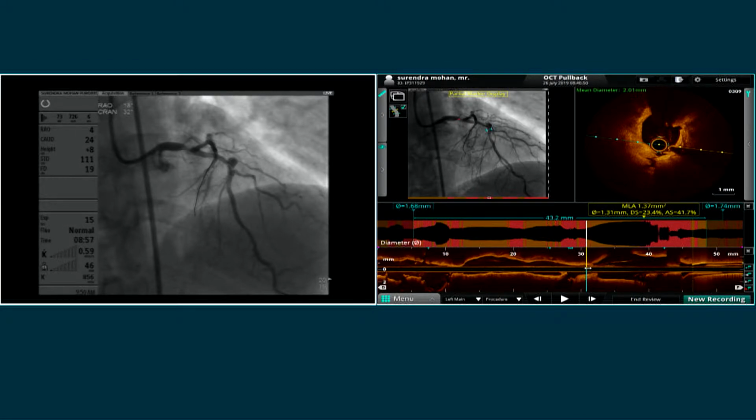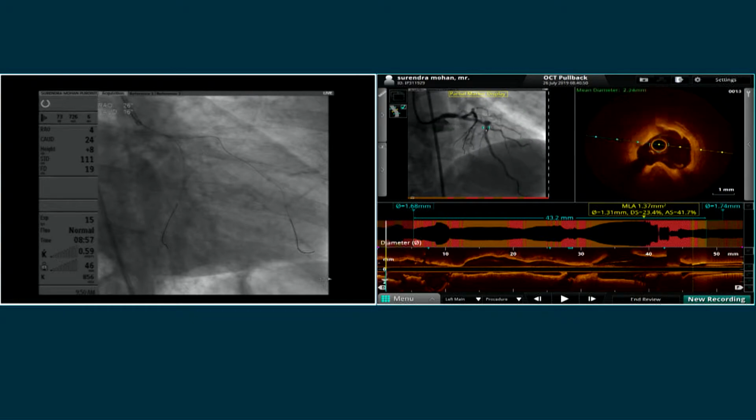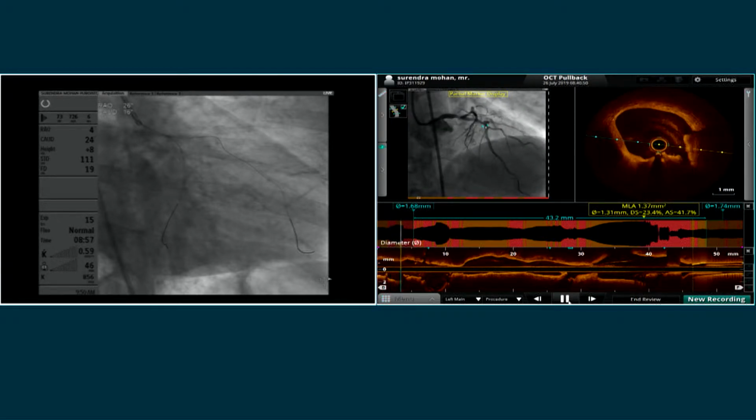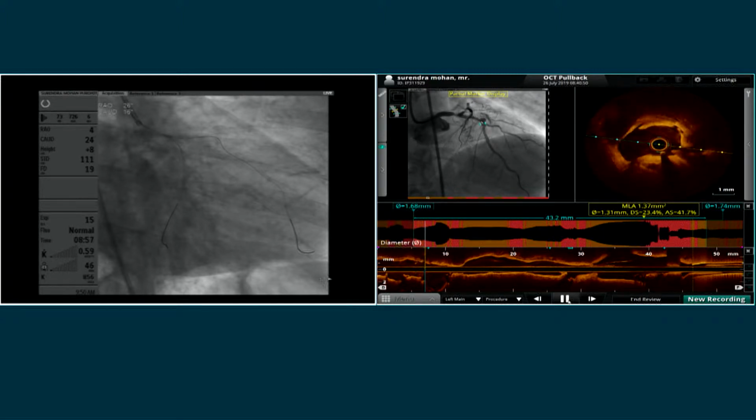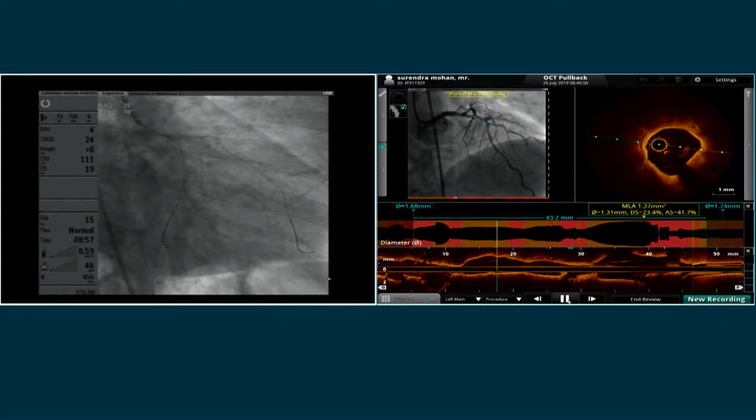Yeah, and just before you go to that, just for the audience, I think that sometimes if you're going to be working on that mid to distal LAD or the mid LAD, with that tight of a left main, you often need to balloon the left main first to get flow, especially with the right occluded, the OM occluded, because the patient may not tolerate these long imaging runs. He had angina, and that's why we went ahead and dilated with a 2.5 balloon. After that, it stabilized. You are right, he had angina. With a tight left main, after ballooning it stabilized.